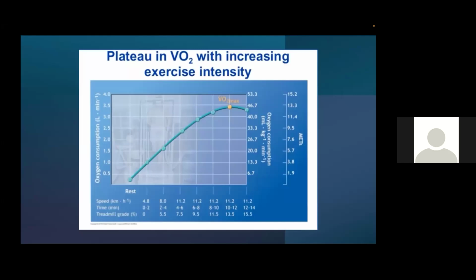So as shown in this curve, we have what we call the 9-panel plots in the CPET reports. We're looking at the curves. One of the most important curves is the peak VO2. Normally it should peak and plateau at the peak of exercise.